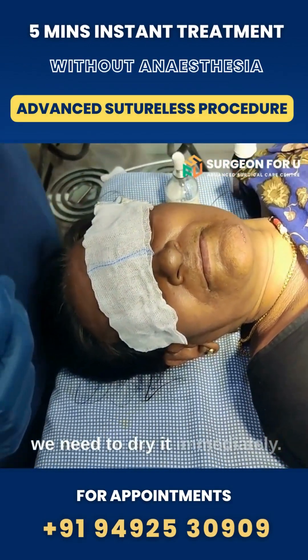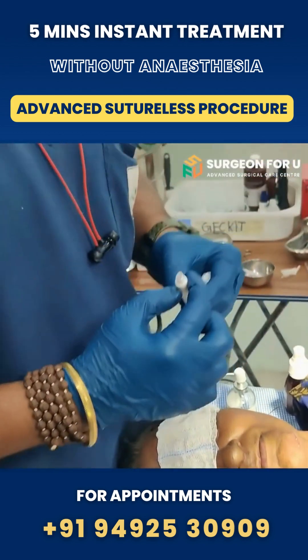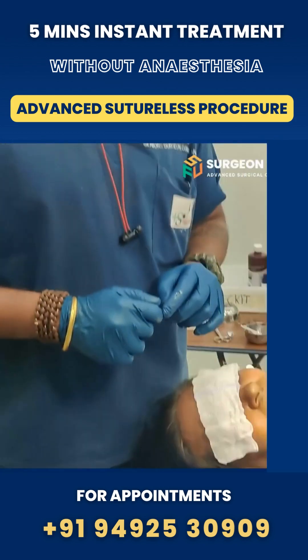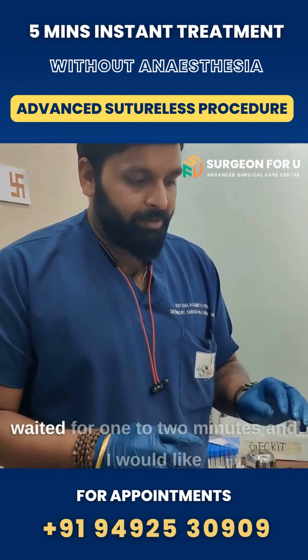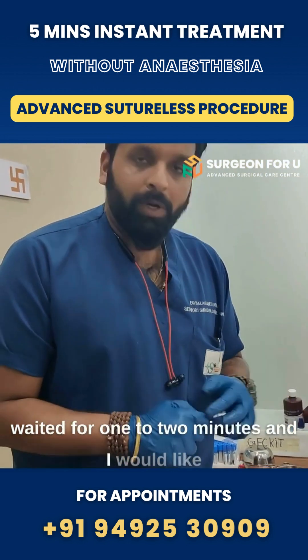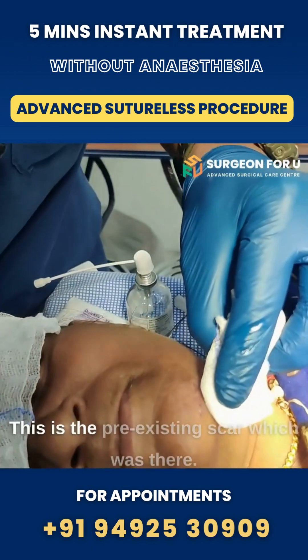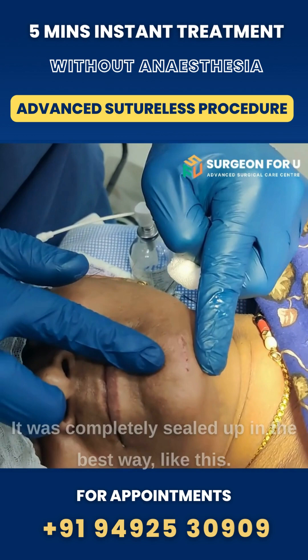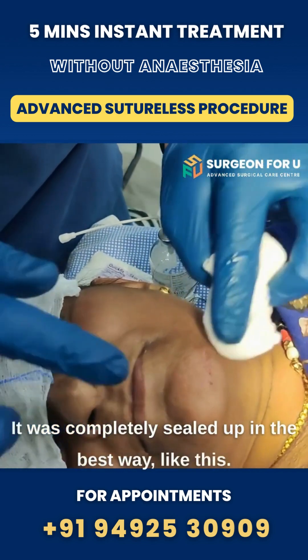We need to dry it. We should not do anything for a while — this will be nice. After putting the glue, we have waited for one to two minutes, and I would like to show you how the scar is better sealed. This is the pre-existing scar which was there; it was completely sealed up in the best way.